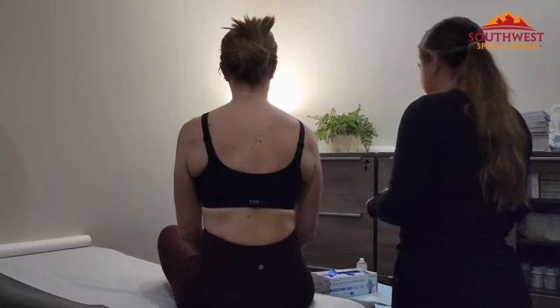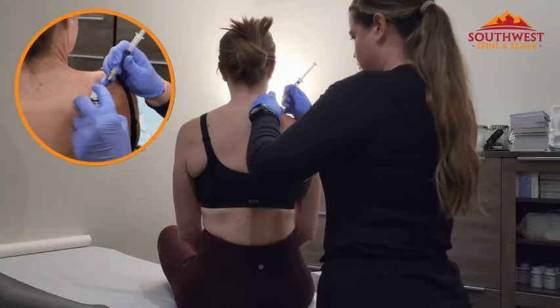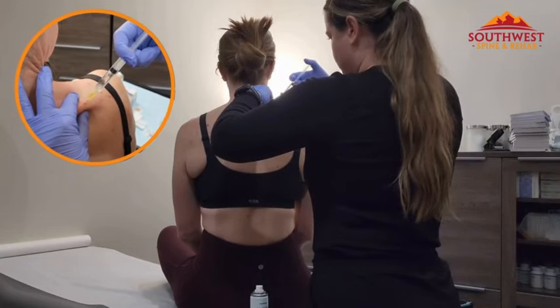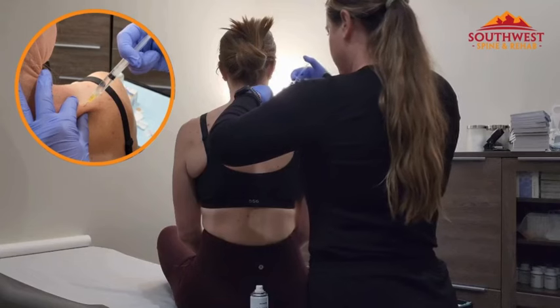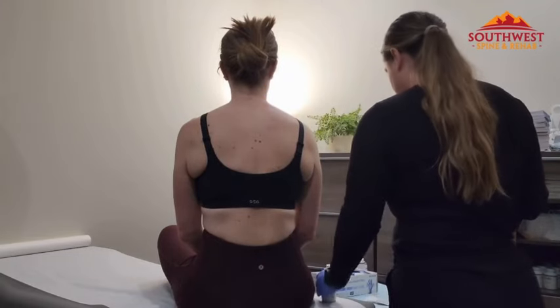You're going to see here with a can of cold spray, which will completely numb the area so that the patient is really not going to feel anything other than the cold. On video it's really difficult to see the injectable because the needle is so small. But she's kind of fanning out as she injects the lidocaine, and it's helping to break down that tissue from the inside out.